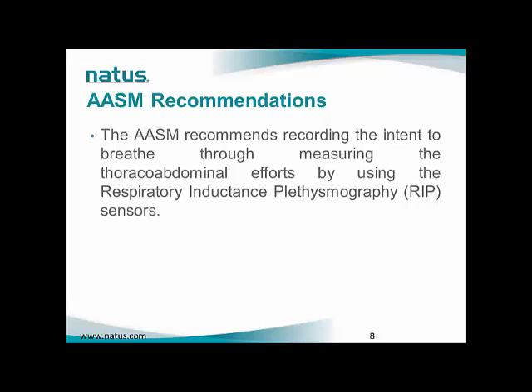The AASM recommends recording the intent to breathe through measuring the thoracoabdominal efforts by using the respiratory inductance plethysmography sensors, which detect the expansion of the chest wall and abdominal circumference, reflecting the attempt to increase the volume of the thorax by muscular effort.